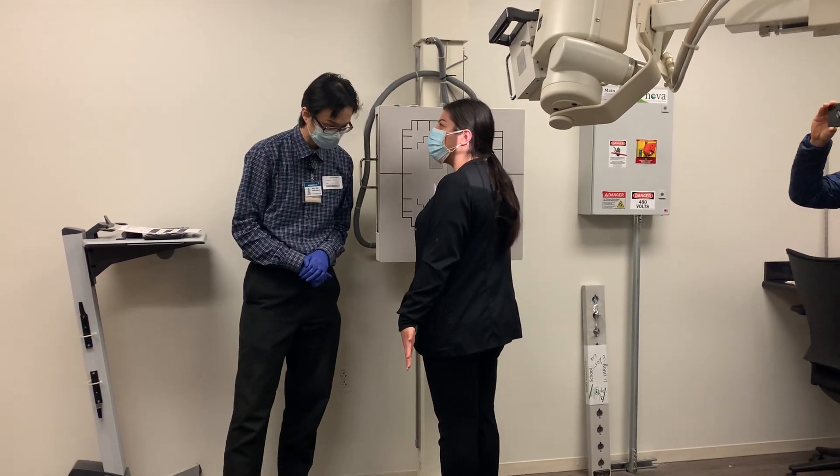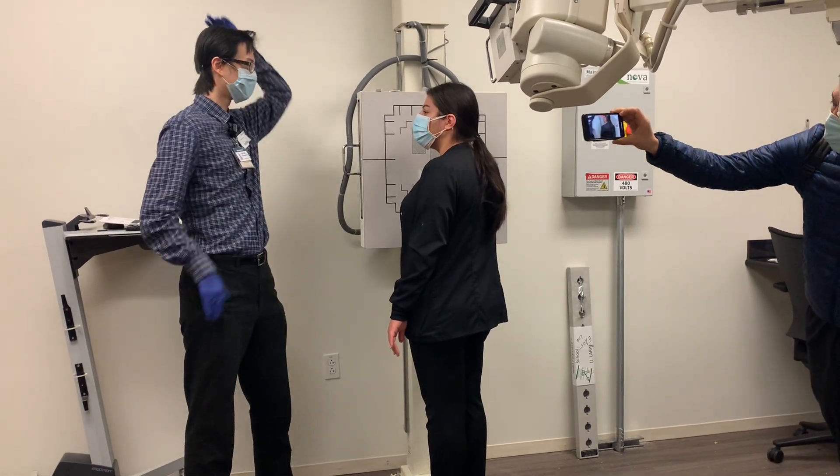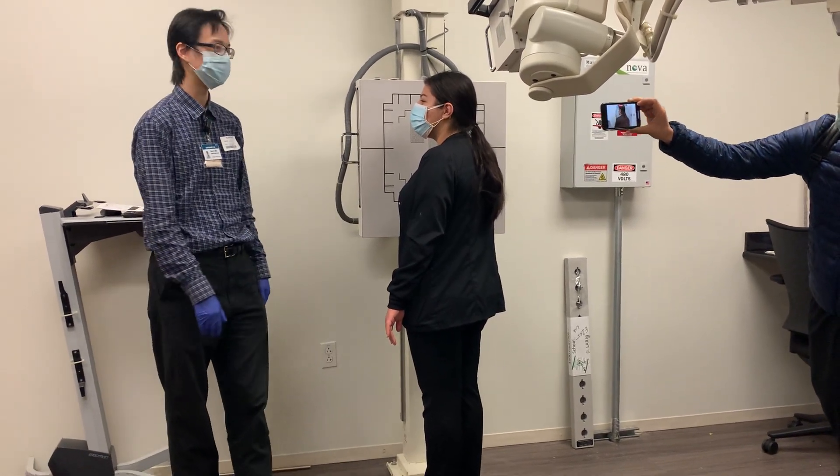I have a quick question — so the hands just stay down? Hands just stay down. No fancy arm this time.